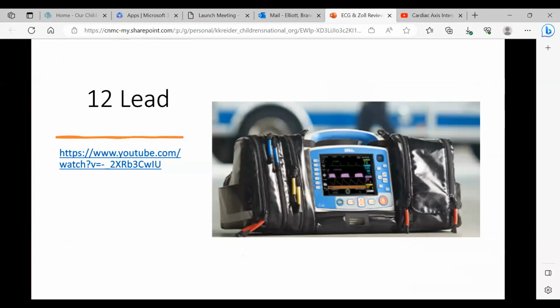Yes, ma'am. All the data that it printed on the second page of the interpretation, did it print in that EKG strip you printed? All of it? Yeah. Okay. So the same data you'll get on your screen is the one you print out. That's interesting. Have you ever paid attention to it before?